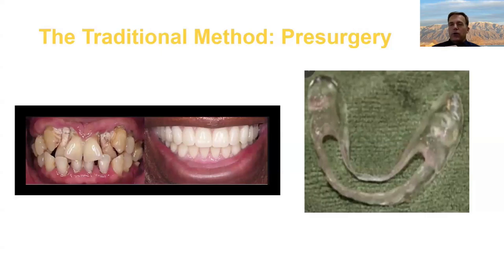When a patient comes in who would like to do this, you can work with us, your lab, or your surgeon to plan out what's going to be best for this person. Statistically, the average person who comes in for this treatment has 6 to 8 failing teeth per arch. It's less common to find edentulous people. Because their primary concern is that they're afraid they're going to have to live without teeth, this whole process is geared towards getting them in teeth on the day of surgery and keeping them in teeth.